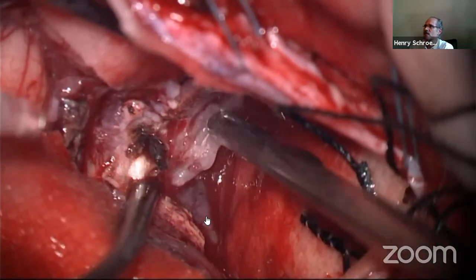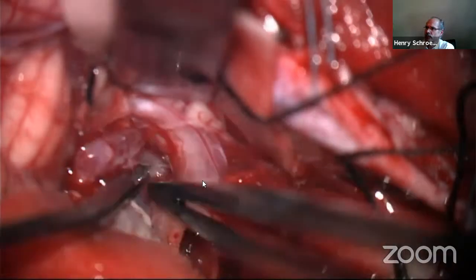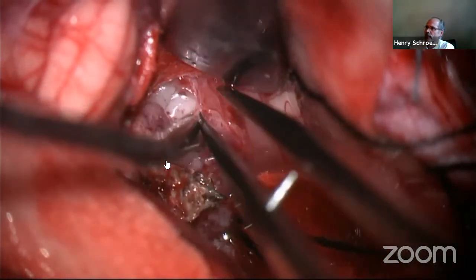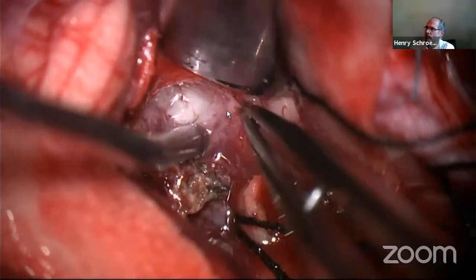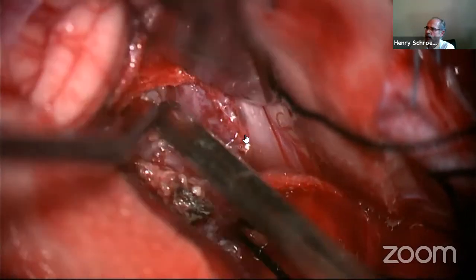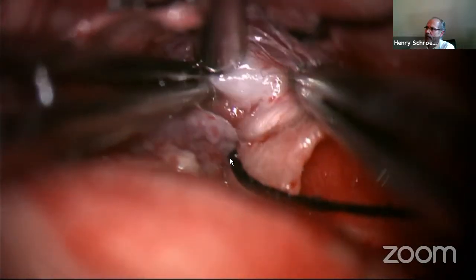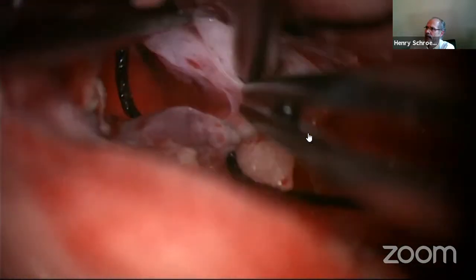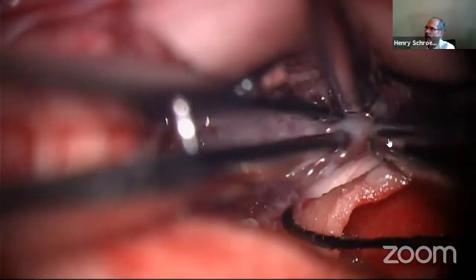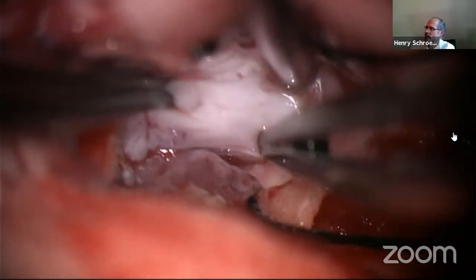And then ultrasonic aspiration is very nice for resection. And you see now we come to the tumor, which extends into the lateral recess. Here you see some plexus, which is dissected away. And then I use CUSA to debulk the tumor in the lateral recess. And here again, there's a good plane. There's a good dissection plane between the tumor and that area. Choroid plexus is dissected.